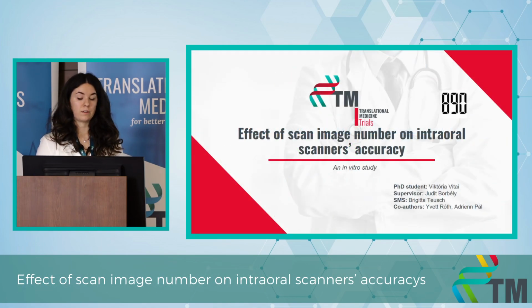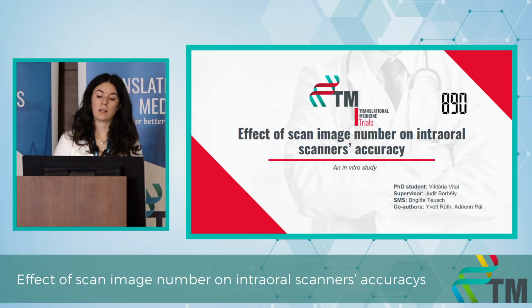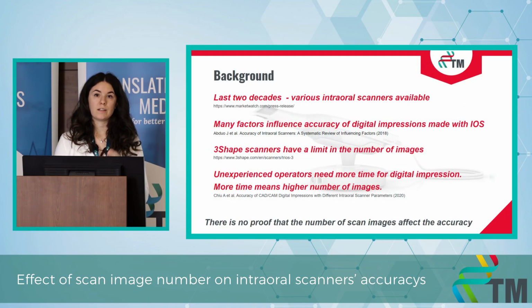I had a third topic this autumn, and this is also about the accuracy of intraoral scanners, but now it is the effect of scan image number on intraoral scanner accuracy. And as I mentioned before, we have many intraoral scanners available, but I have to highlight that many factors can influence their accuracy. For example, the 3Shape scanner, which is available for us in our clinic, it has a limit in the number of images.